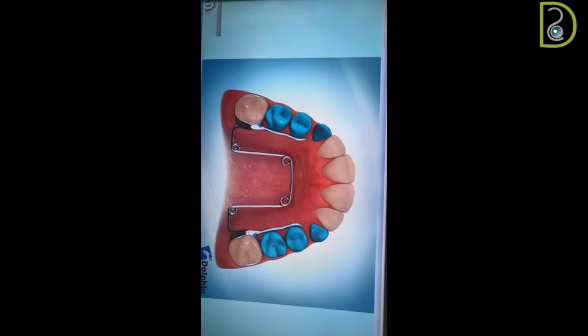Now, I talked about the skeletal, the sagittal part, class 2, class 3. Now I talked about the expansion. We try to avoid expansion in preschool children. 5 and 6 years old, they are very young. Sometimes if you do rapid expansion, you get a facial deformity. You may break the nose for them. So you don't use a rapid expansion in very young kids.